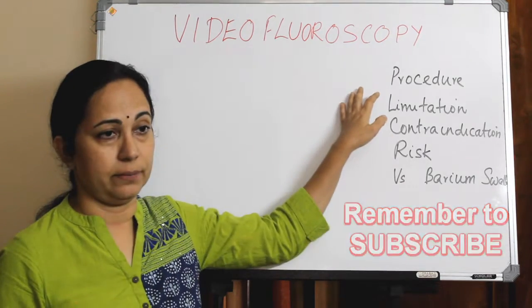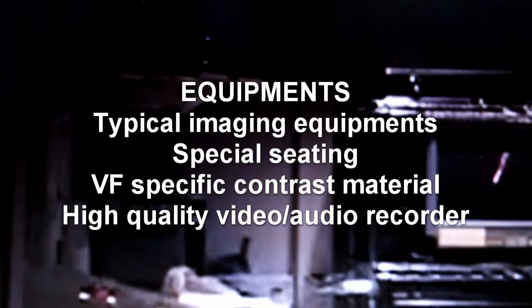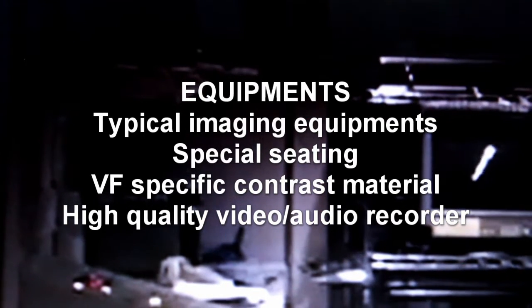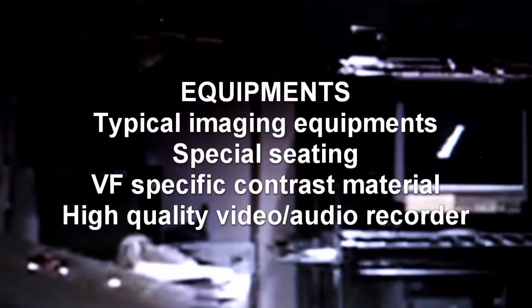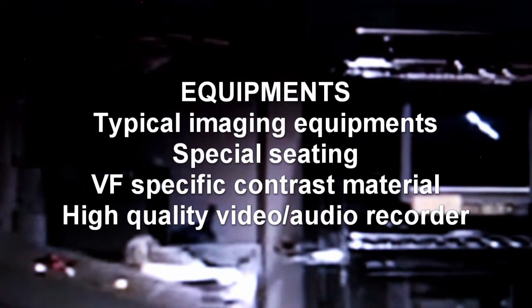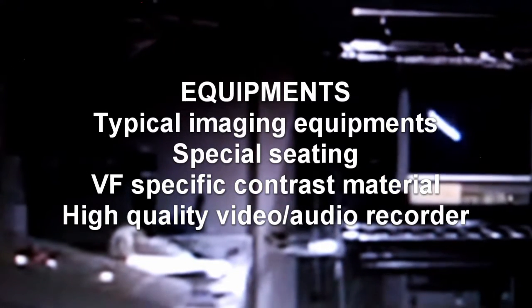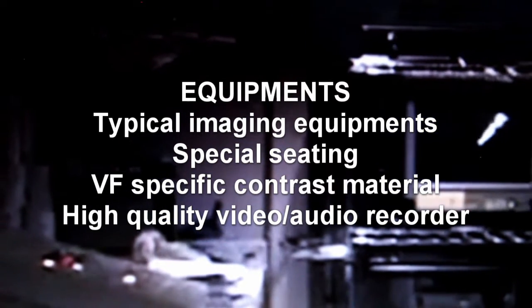So how is it done? The typical imaging equipment found in a modern radiology department is required, along with the special commercially available videofluoroscopy specific contrast materials, and an ability to make high quality video or digital recordings with the sound, with the capability for slow motion and frame by frame analysis. Downloading the study onto the computer enables dynamic swallow study measurements.